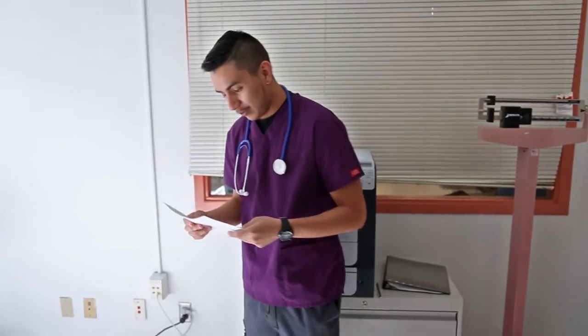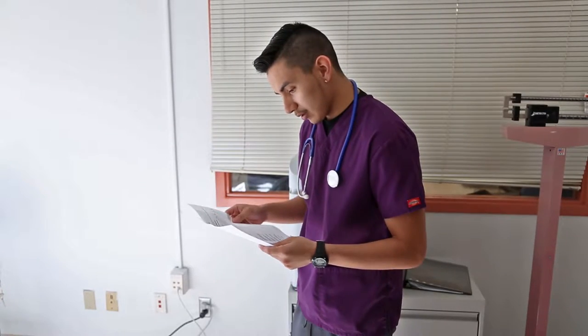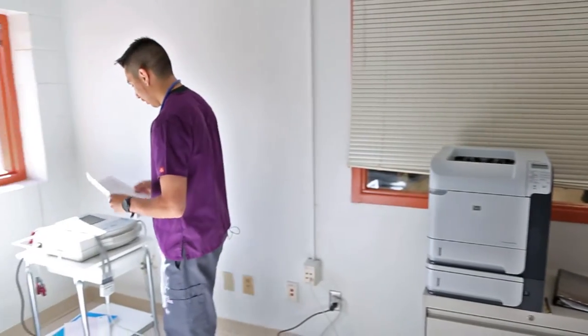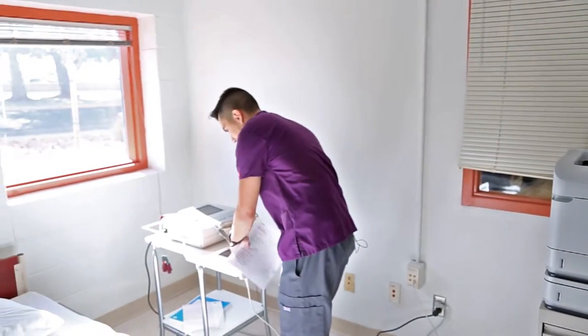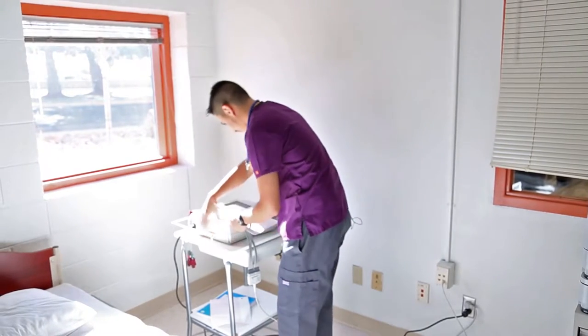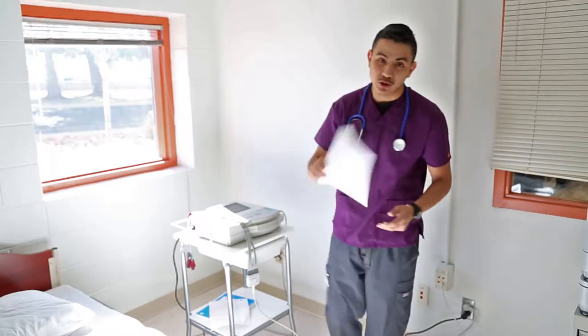Looks like an order just came in for a 12-lead ECG for Mr. Marcus. I'm going to make sure the machine is working properly, make sure I have all my electrodes, make sure there's adequate paper, and we'll go ahead and enter the data when Mr. Marcus comes in.